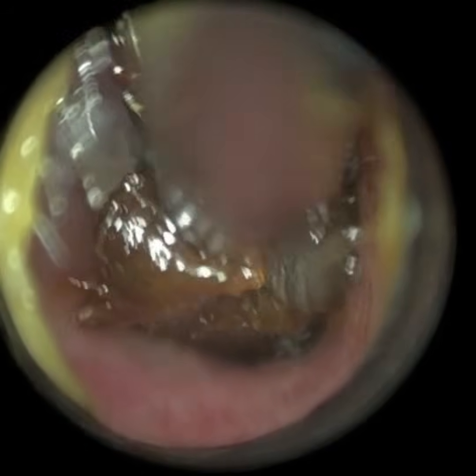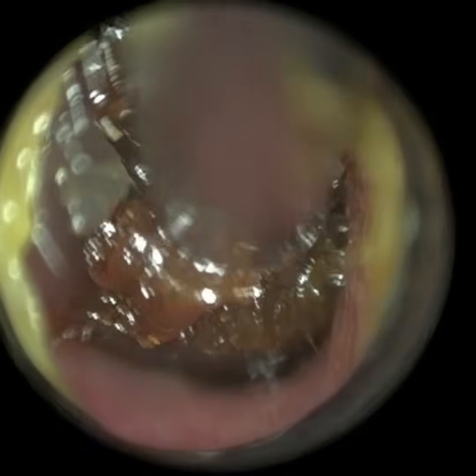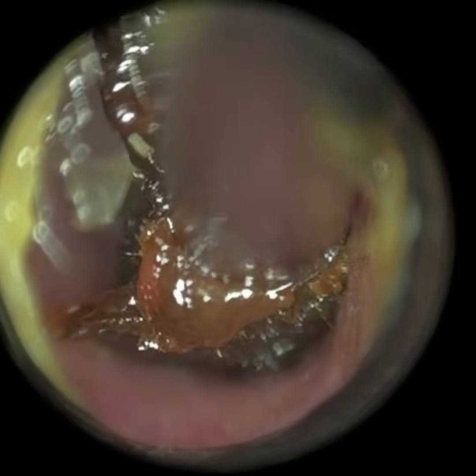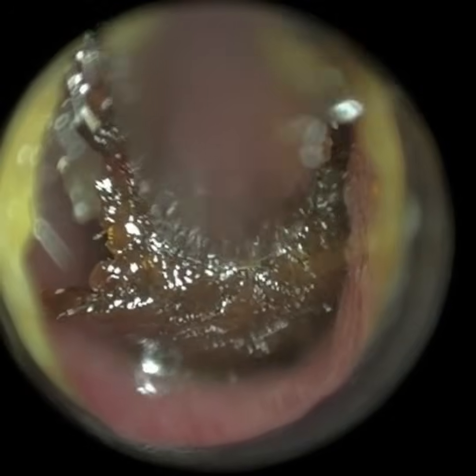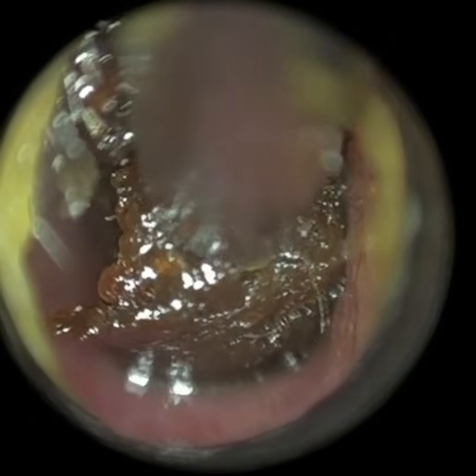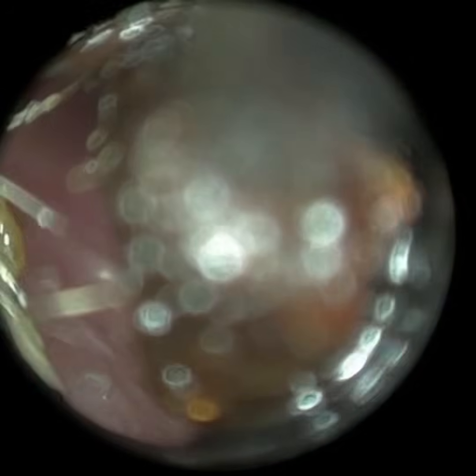I don't know what it is in the last couple of weeks, my regular patients with really, really deep anterior recesses have all been coming in. And I will also upload some very narrow ear canals that I've treated using the size 1 specular. These are the trickier, more complex ones, although this one was pretty good, actually. It was not as difficult as usual. So I managed to bring that out.